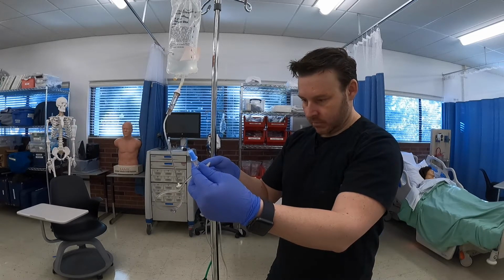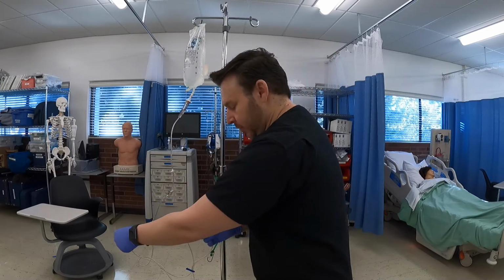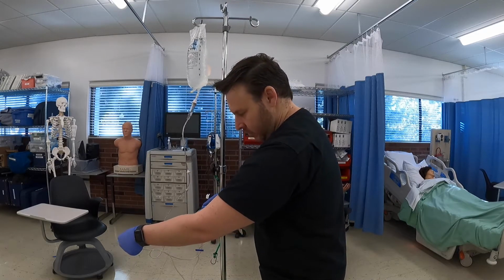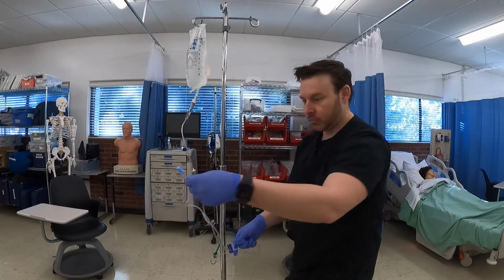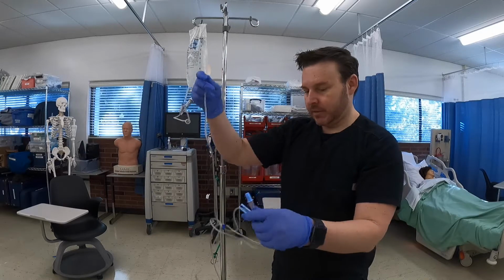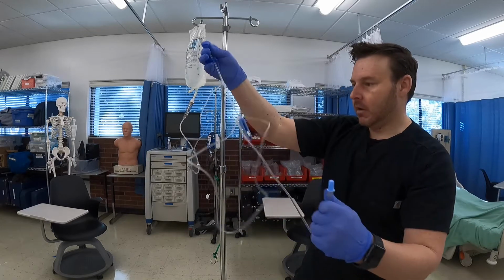All right. And then you might get a little bit of liquid coming out of your blue tip, so you can hold it over a trash can or a sink as it's going. All right, so now my last air bubble has gone through. So then I clamp my roller clamp, move it back into the tight position, and then I'm going to inspect my tubing one last time to make sure that there are no air bubbles in the line.